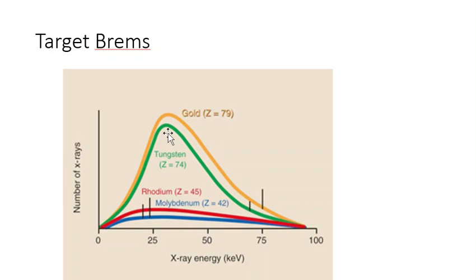If there ever comes a time that we have to calculate technique compensation for changes from molybdenum to tungsten targets, then I'll incorporate that into the lecture.